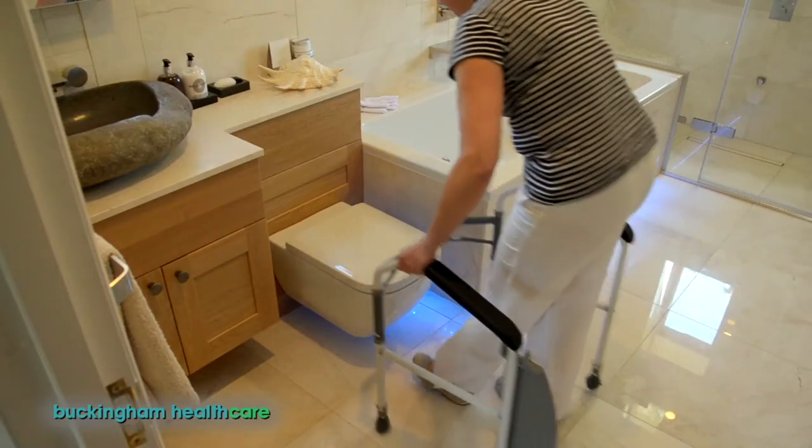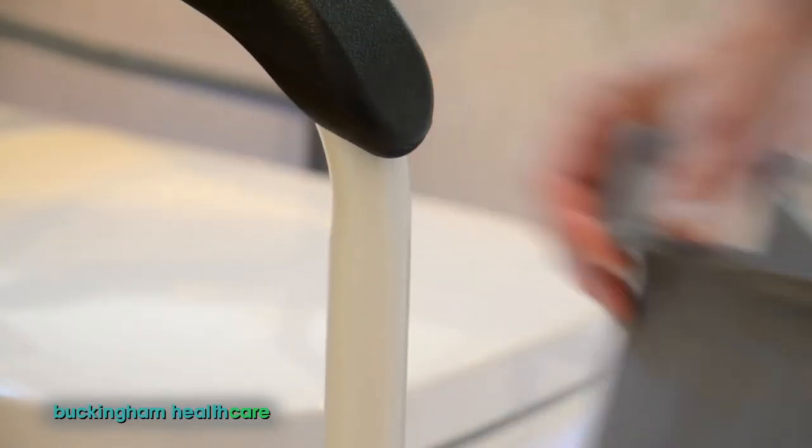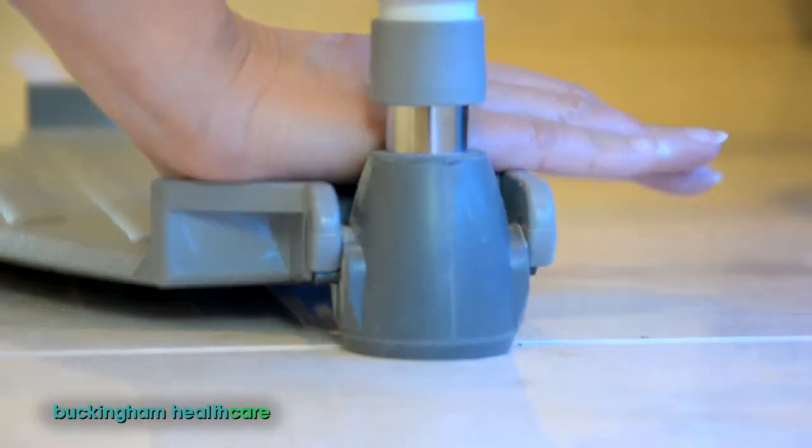Walk into the frame and lift it towards your toilet, then unclip the footplate, ease it down onto the floor and snap it into place.